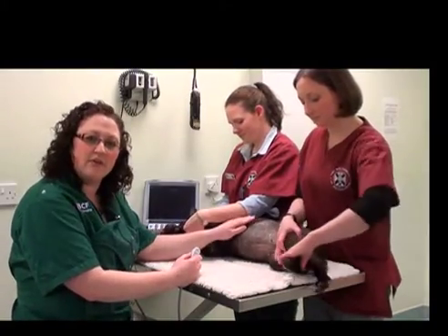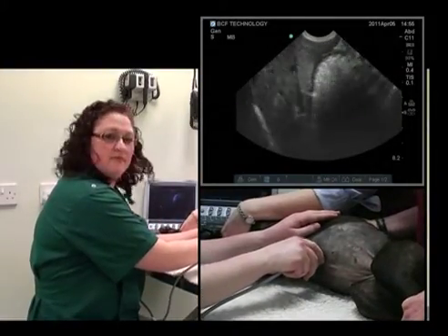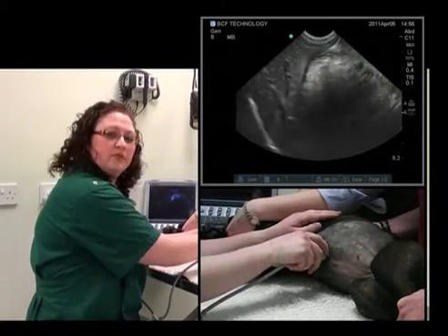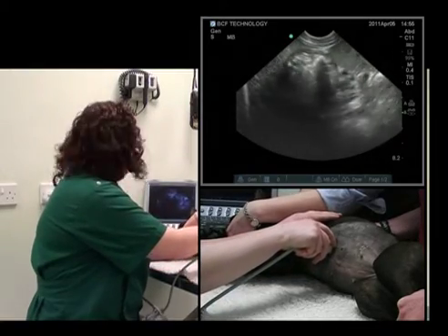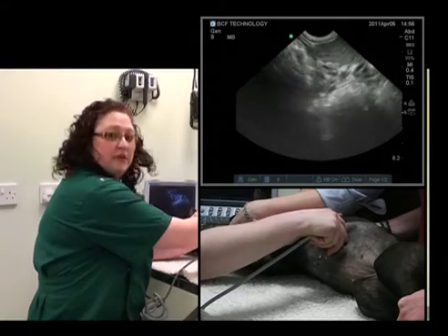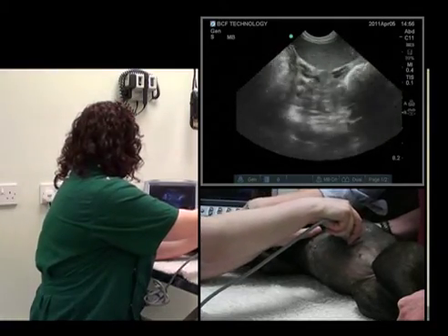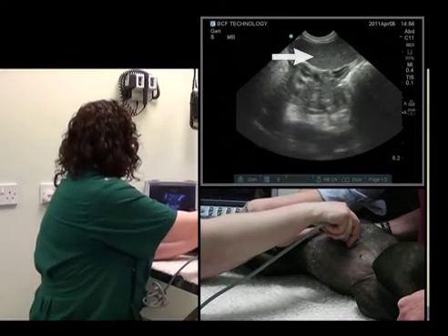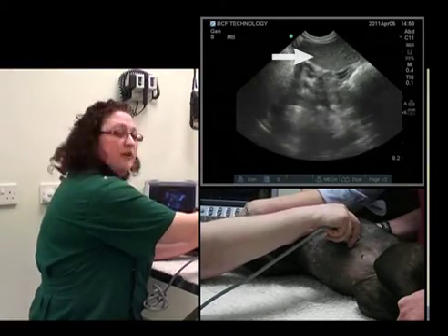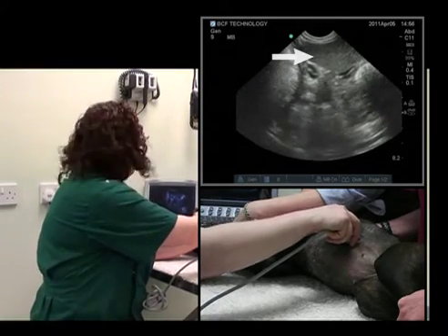We'll start at the level of the xiphoid sternum in the sagittal plane, and we'll slide along the level of the ribs, and the spleen starts to come into view. There it is at the top of the screen. What I now need to do is alter the overall gain, the time gain compensation, and the depth appropriately.